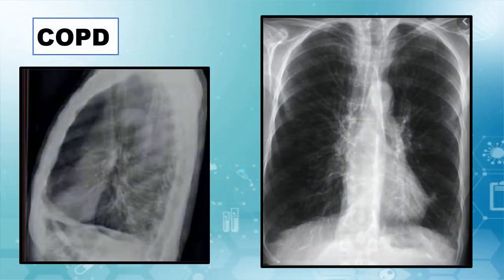COPD produces thorax expansion, which is characterized by a lower and flattened diaphragm and an anterior-posterior chest cavity length equal to the lateral length. Moreover, it is very remarkable to find a translucent parenchyma and bullae, which look like big spaces of free air.